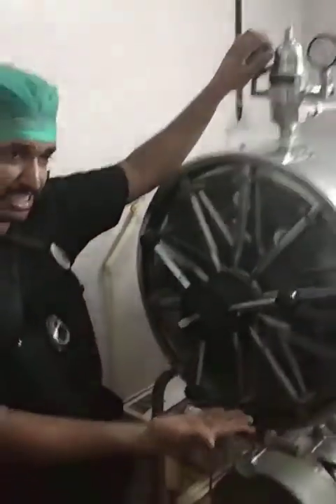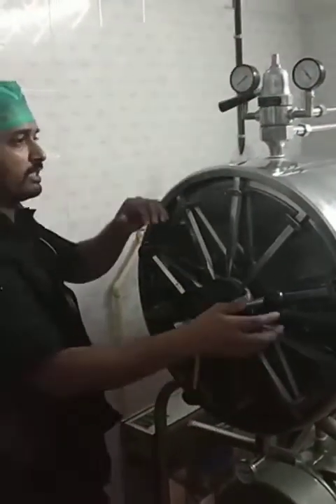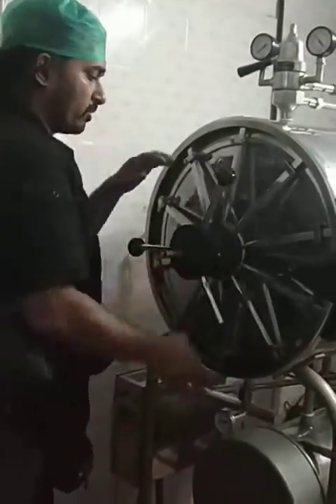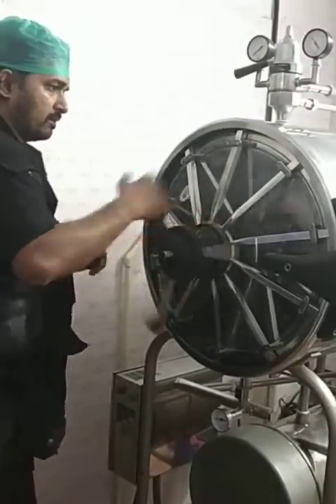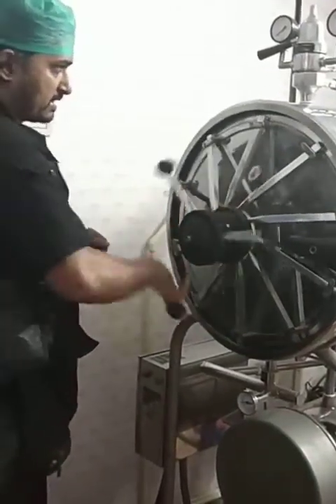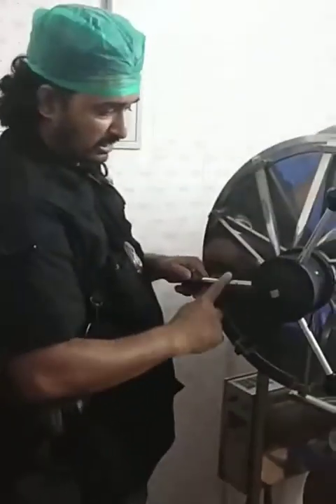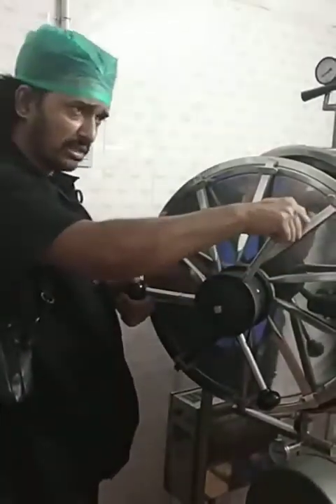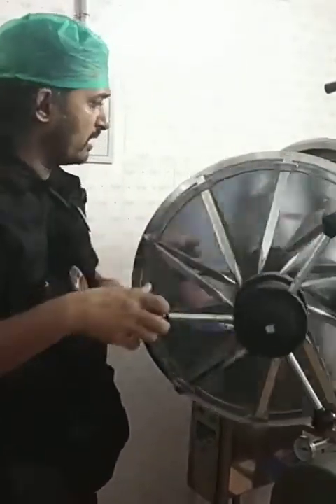The vents from where steam was coming in or exhausting get closed. That is the time we open the autoclave again in the anticlockwise direction and get our sets out, remembering that everything inside is going to be hot. The handle here is specially made of plastic or fabricated materials so that it doesn't hurt our hands, but you still have to remember everything inside will be hot.